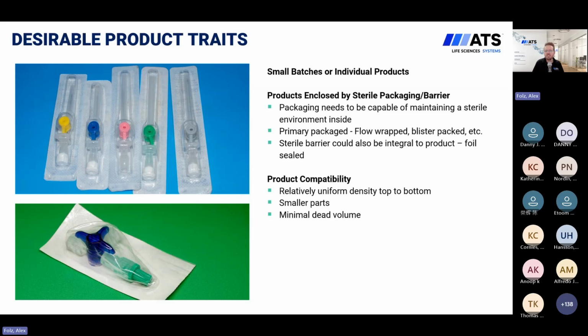You might notice that under product compatibility, I'm using a lot of relative terms here, right? And that is because the best way to determine product compatibility and really start to get down to actual numbers is to do the dose mapping testing, right? That's really the best way to come back with both that technical and commercial feasibility.